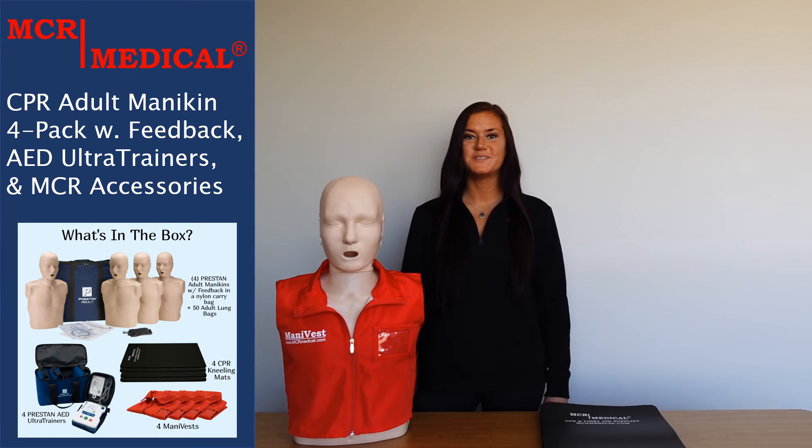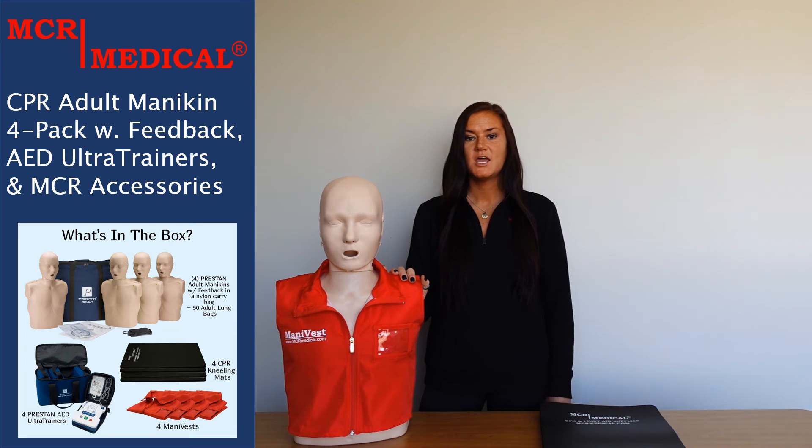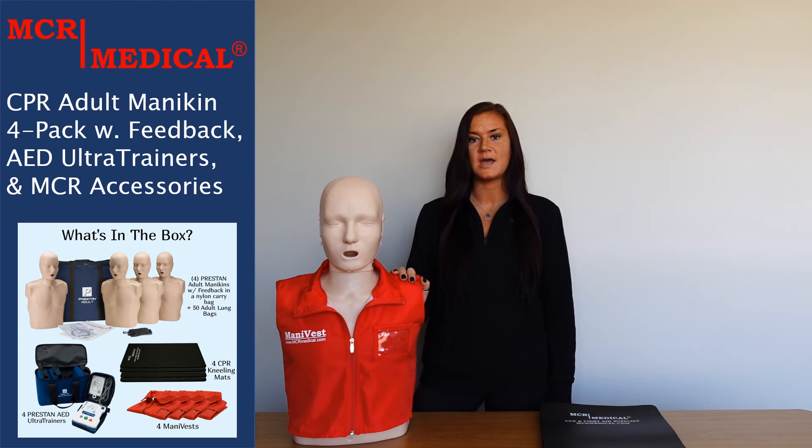This kit also includes some MCR Medical accessories that are sure to enhance your CPR training classes. You will receive four mani vests, which will help keep your mannequins clean and looking stylish, and provide a lifelike training scenario for students as they have to practice removing clothing before applying AED pads.